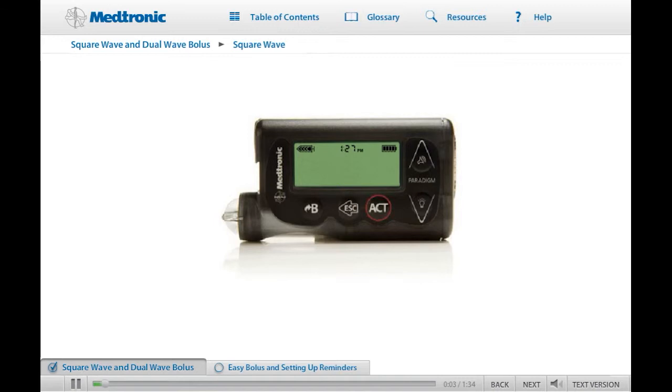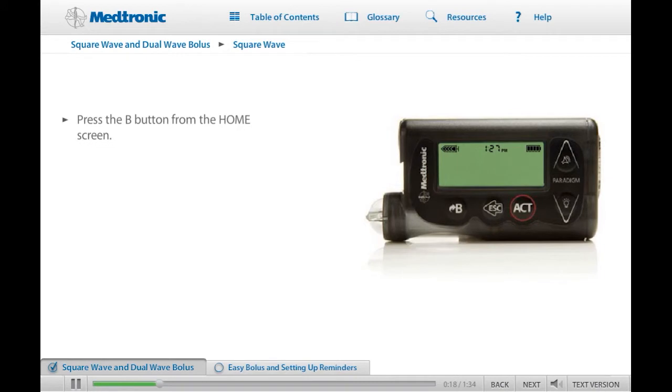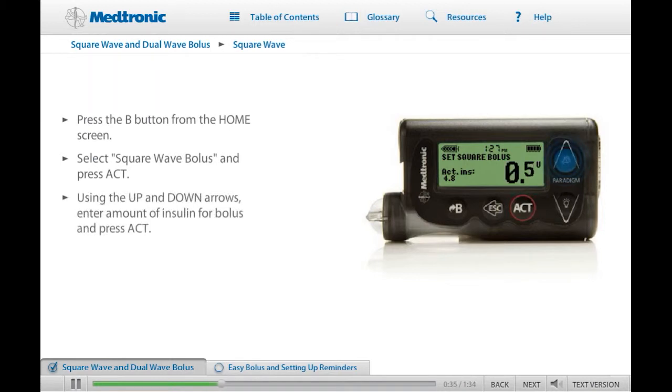First, we'll program a square wave bolus. For this training, we will demonstrate programming without the Bolus Wizard feature. For information about setting a square wave bolus with the Bolus Wizard feature, see the User Guide. To start, press the Express Bolus button or choose Set Bolus in the Bolus menu. The Bolus Type screen will appear. Select Square Wave Bolus and press Act. The Set Square Wave Bolus screen will appear. Enter the amount of insulin you have determined for the square wave bolus units and press Act.